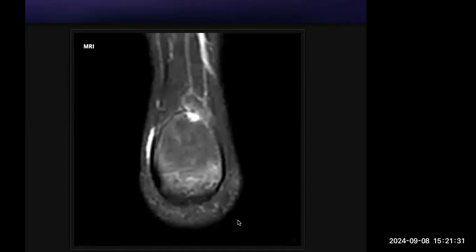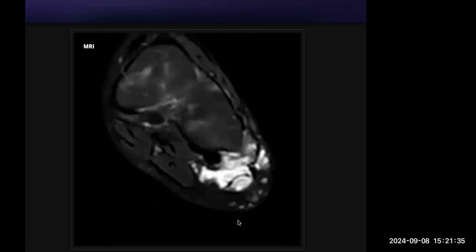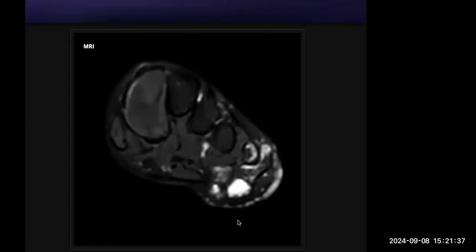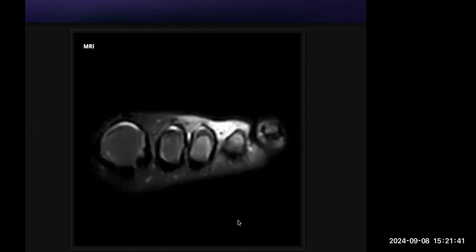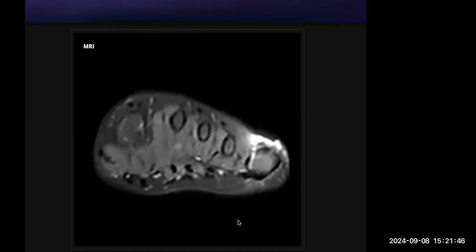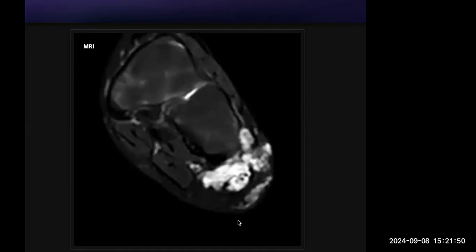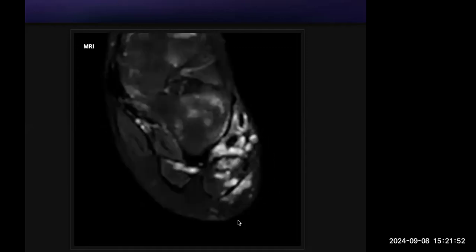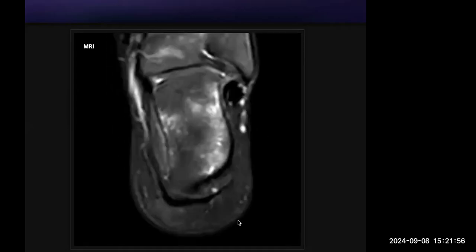What information on CT can let me know if it's a slow flowing malformation? On CT, there will be progressive enhancement. If it's a venous malformation, it will show progressive enhancement in the venous phase. Let's say the technician could not do a proper protocoling of the sequences. What other information can help me to think that it could be a slow flowing malformation? Any phleboliths seen on the CT or on the radiograph that will help in correlating with that.